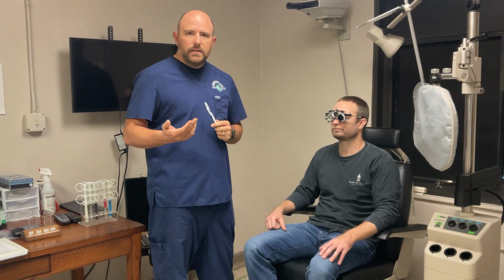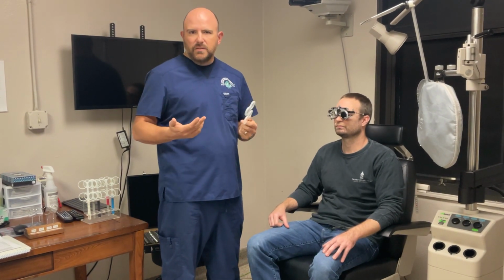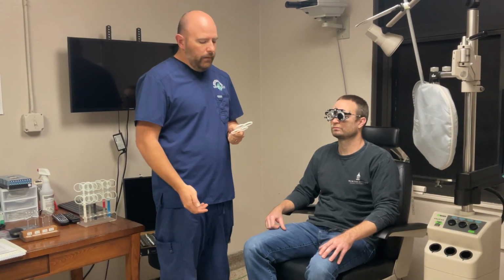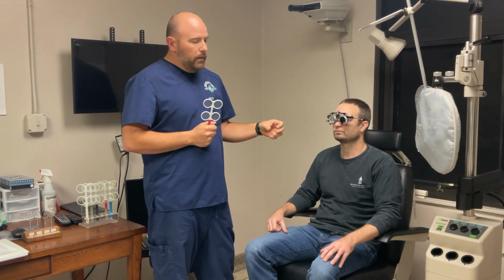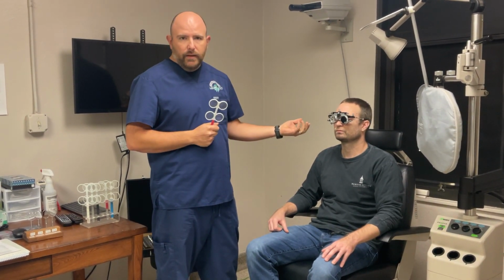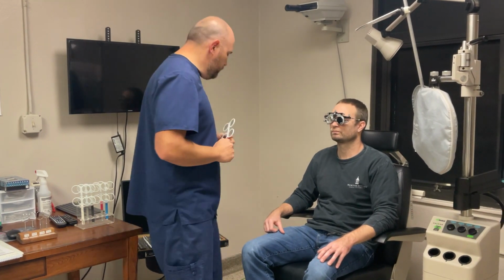So in these cases, the patient wanted more minus initially, and now is kind of giving me mixed signals that maybe plus might be helpful or something like that. I'm going to remember that because his true refraction, he started off at a minus 350. Now we've got a minus 450 sphere in there. The true refraction may be somewhere in between. But for now, we're going to move on with the refraction, and we'll come back to that later. So that's the end of initial sphere there.